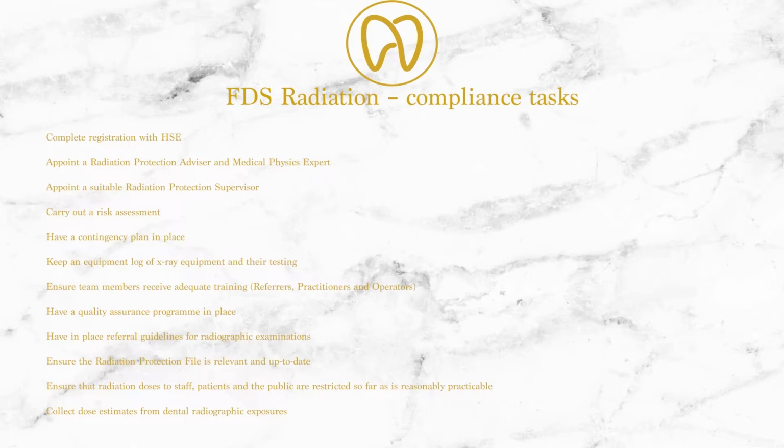We have a quality assurance program in place, which we'll demonstrate later in this video. All x-rays are graded either 1, 2 or 3 based on their quality and whether repeat exposures are required to achieve a diagnostic image. We have referral guidelines in place, and the radiation protection file is a joint responsibility to be updated, and any event should be communicated to the practice manager and then recorded in the radiation protection file. The radiation protection file also has the log of all the equipment and the servicing history of all the equipment.